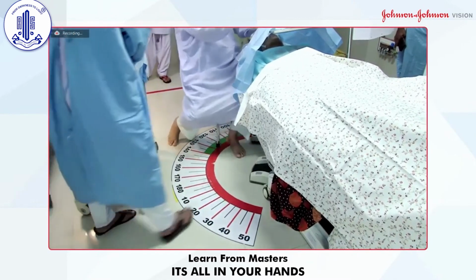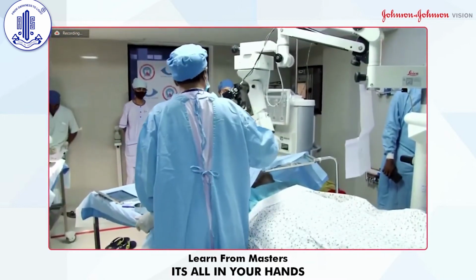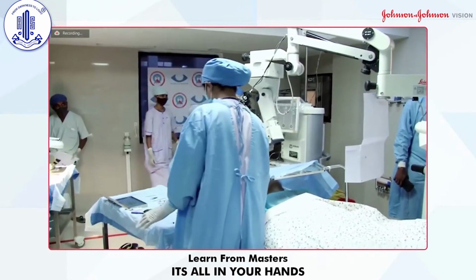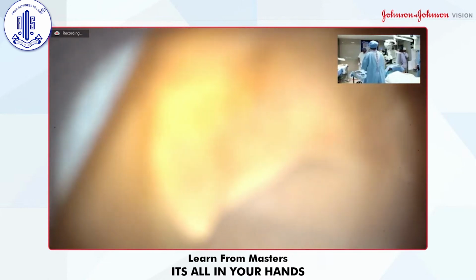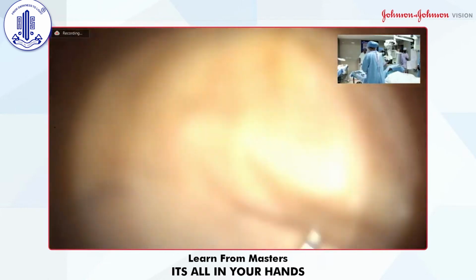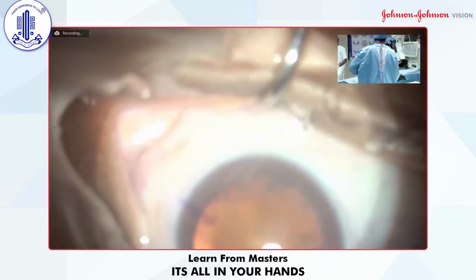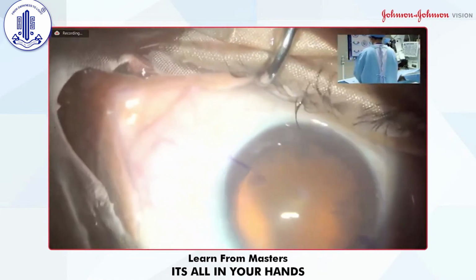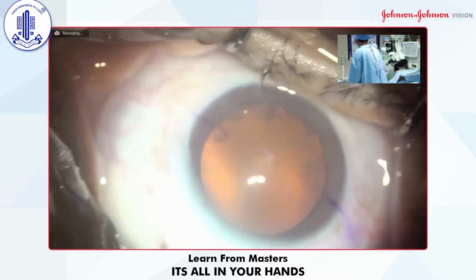And second thing is, if the patient is not comfortable in a vertical incision or in an oblique, you can say the axis, then sometimes I make the head a little bit down. Can I make that down? Yes. So more eye is exposed. Now you can see I am comfortable, patient is also comfortable.